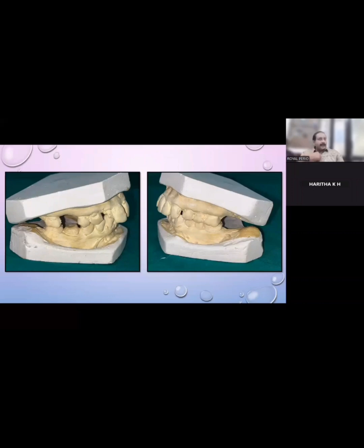Then we need to take an X-ray and confirm the position. Position is anyway you have fixed it. Angulation of it. Then what's the next step? If everything is fine, if it seems to be okay, then what? Go for the next drill, pilot drill. How many millimeters of pilot drill? 6.5. You got a stopper, right? Yeah. So you fix a stopper to your pilot drill and go till 6.5. Okay, then definitely X-ray to confirm it.